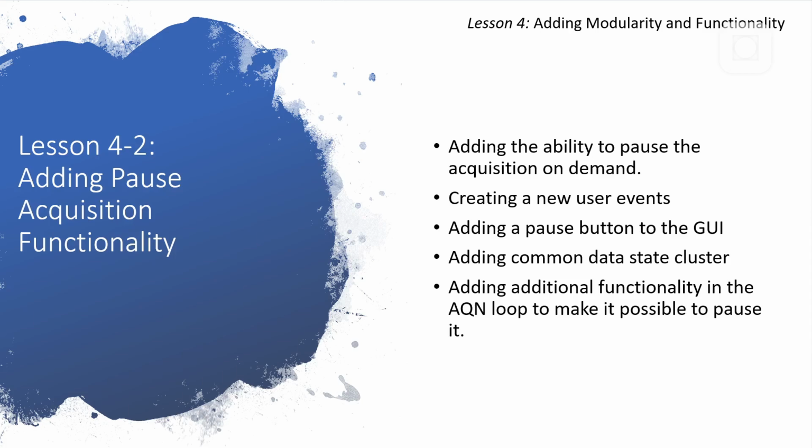As we've seen, when we move our finger, it affects the signal in such a way that it gets too big of a range and we can't see the small changes that the blood vessel blocks for the light in the finger. So if we want to suddenly take a break from measuring the pulse, but we don't want to wait the full 10 seconds for it to come back or more, then we can pause it and then move away, come back, and then resume it.